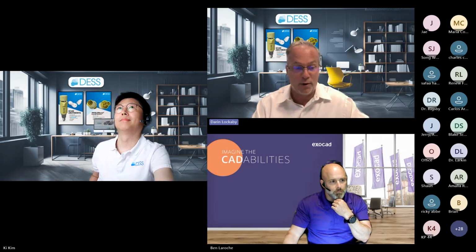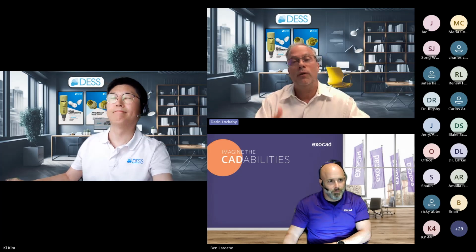We're excited to welcome another great partner of ours in exocad, and Ben from exocad will be sharing some tips and tricks and how exocad works, and specifically with DESS libraries to help you design and get the optimum outputs in your abutments. We're also joined by our own Ki Kim, who is our director of technical support here at DESS, and he'll walk you through our DESS libraries and how to utilize them and download them.